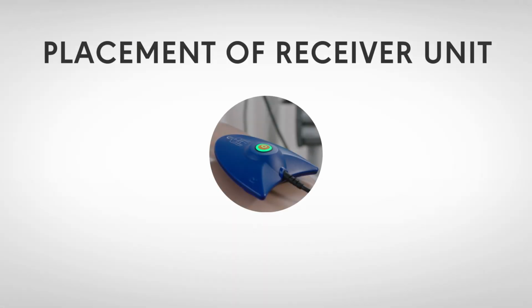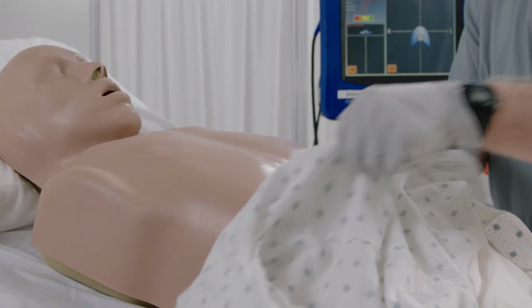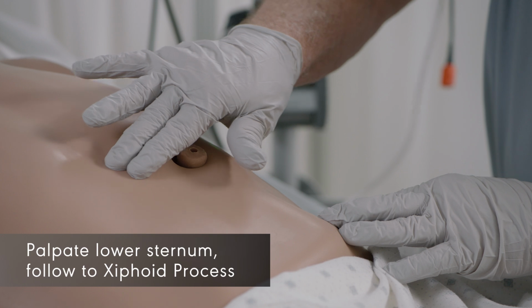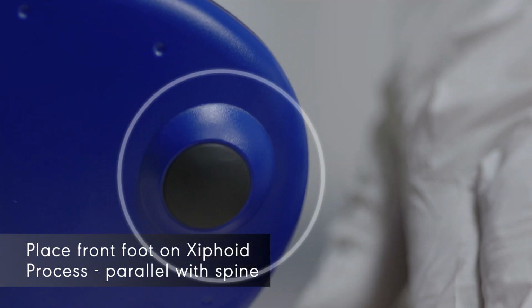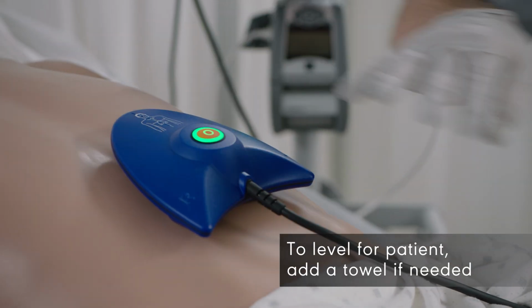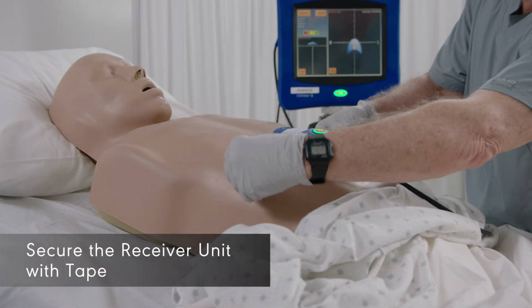Placement of the receiver unit. Palpate the lower sternum and follow it to the xiphoid process. Place the front foot of the receiver unit on the xiphoid process parallel with the spine. To level for the patient, add a towel if needed. Secure the receiver unit with tape.